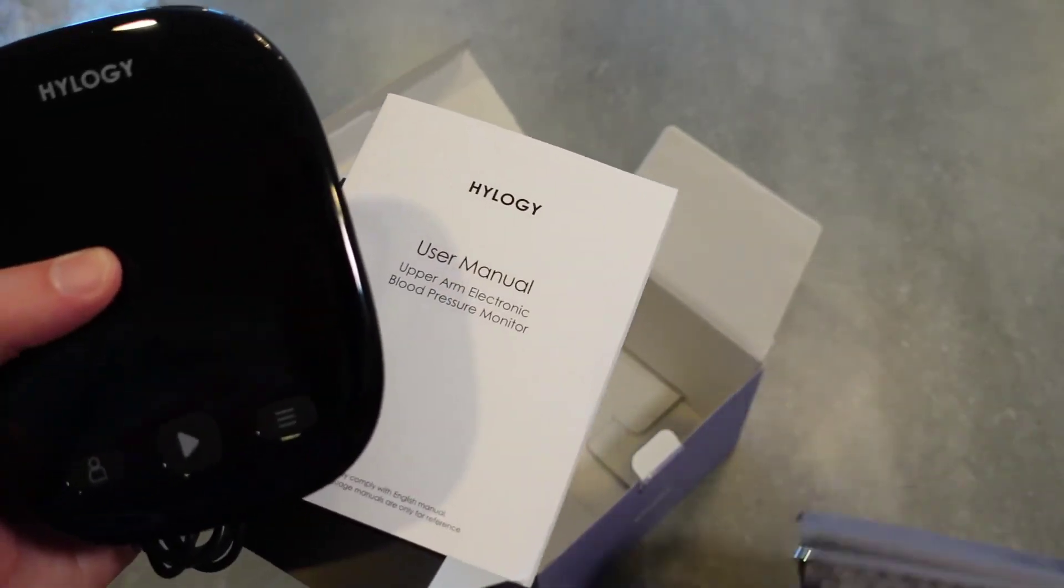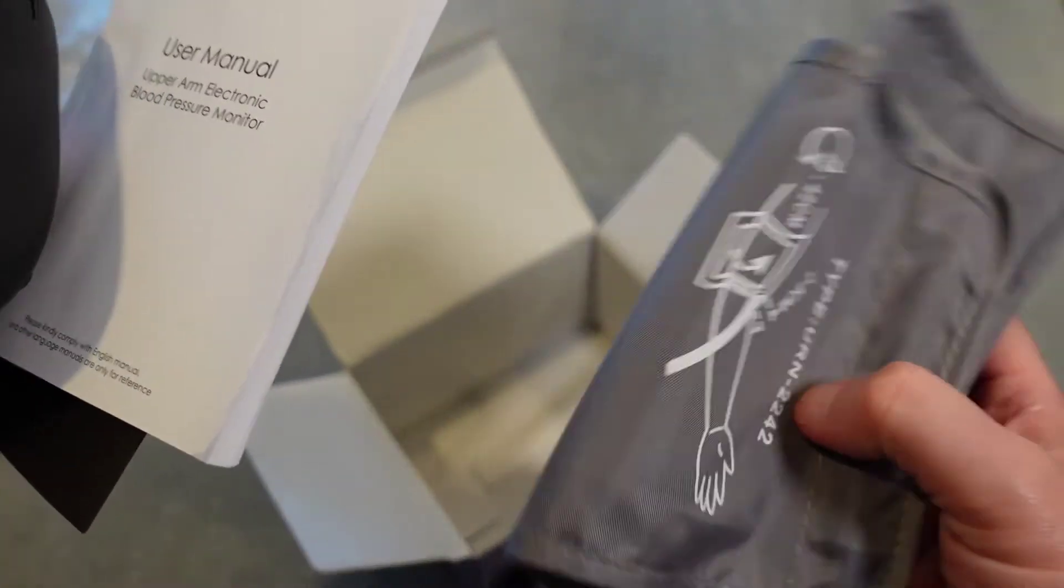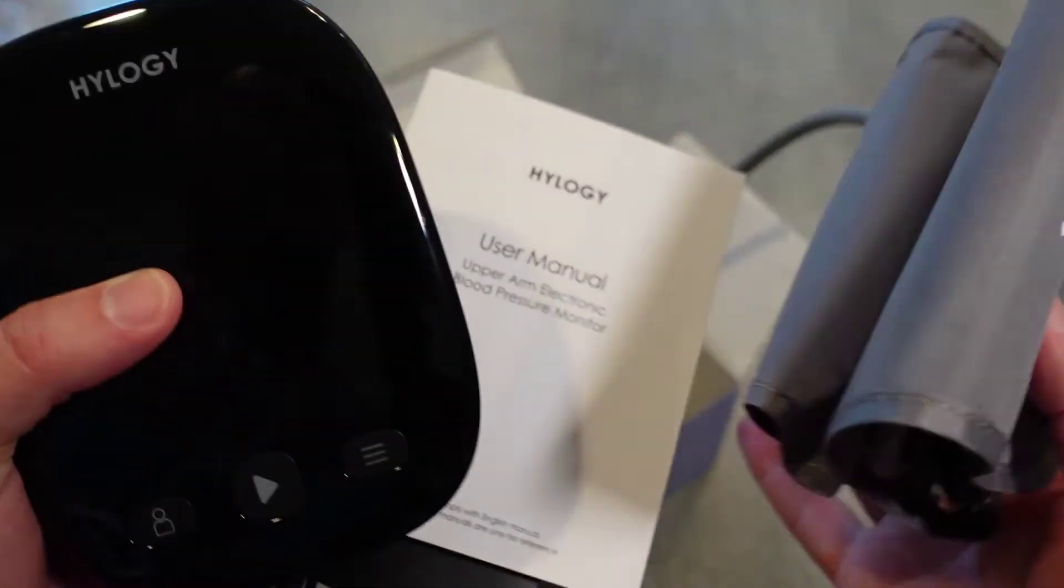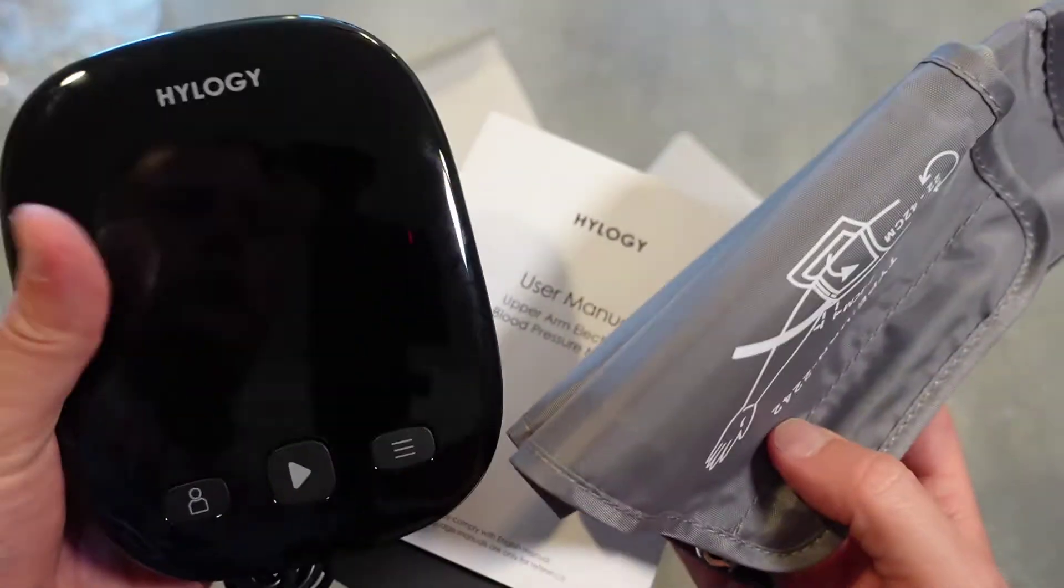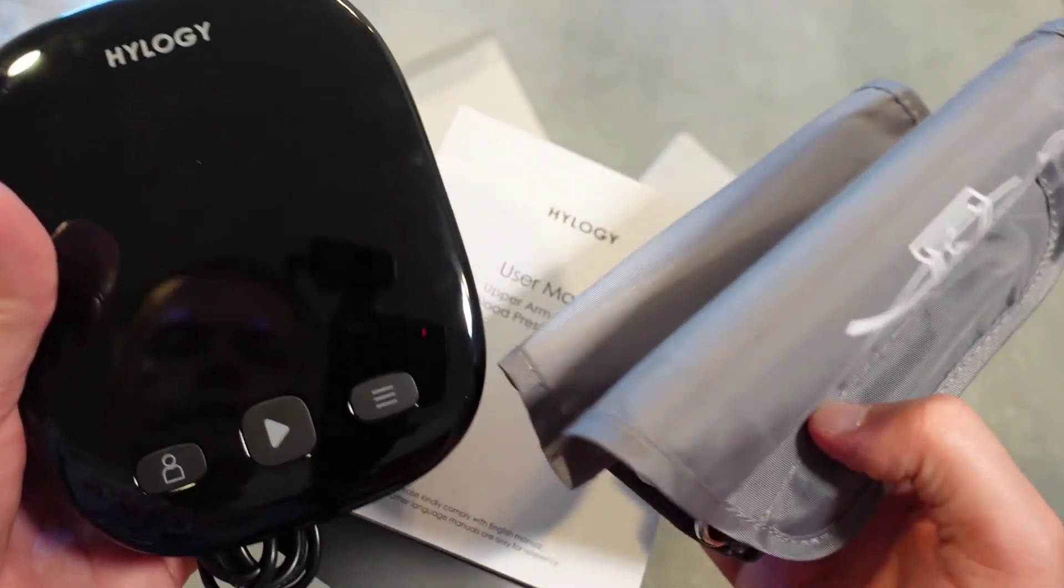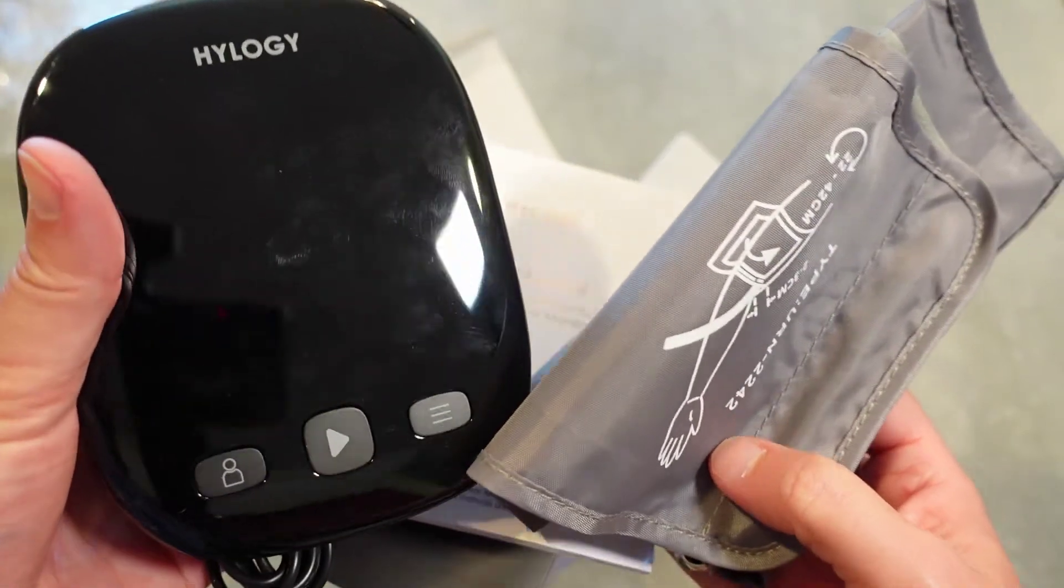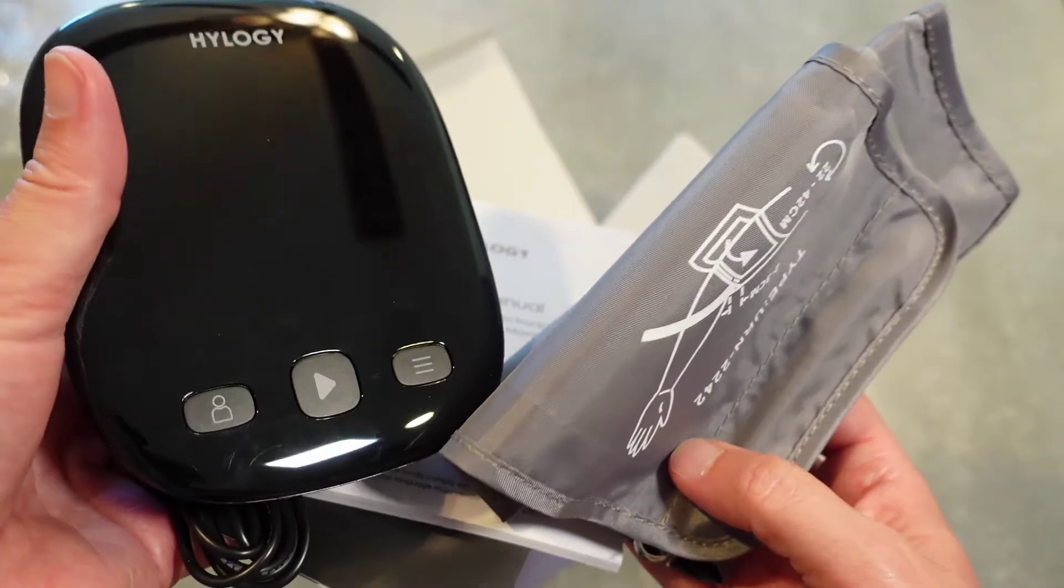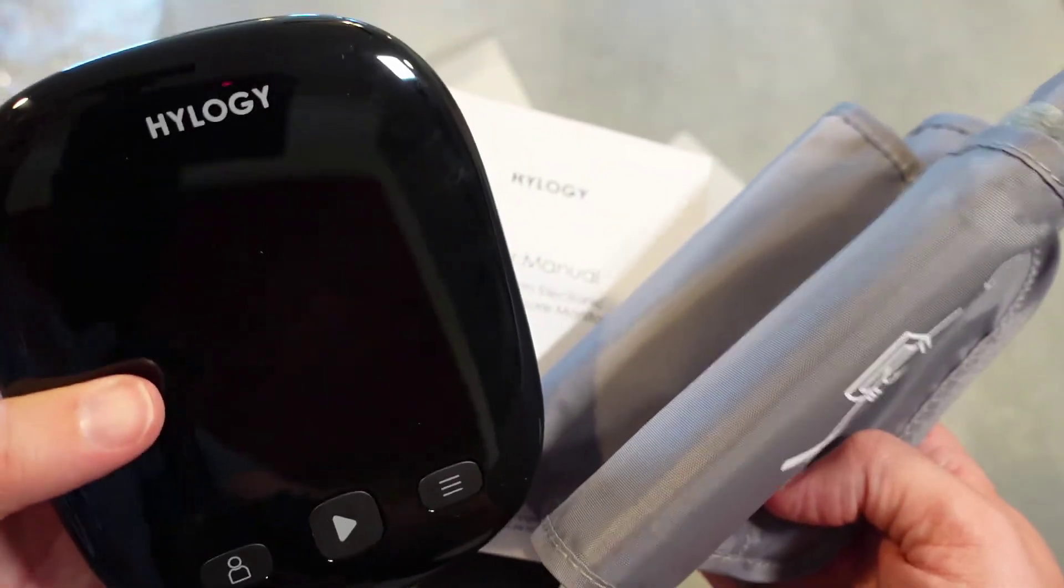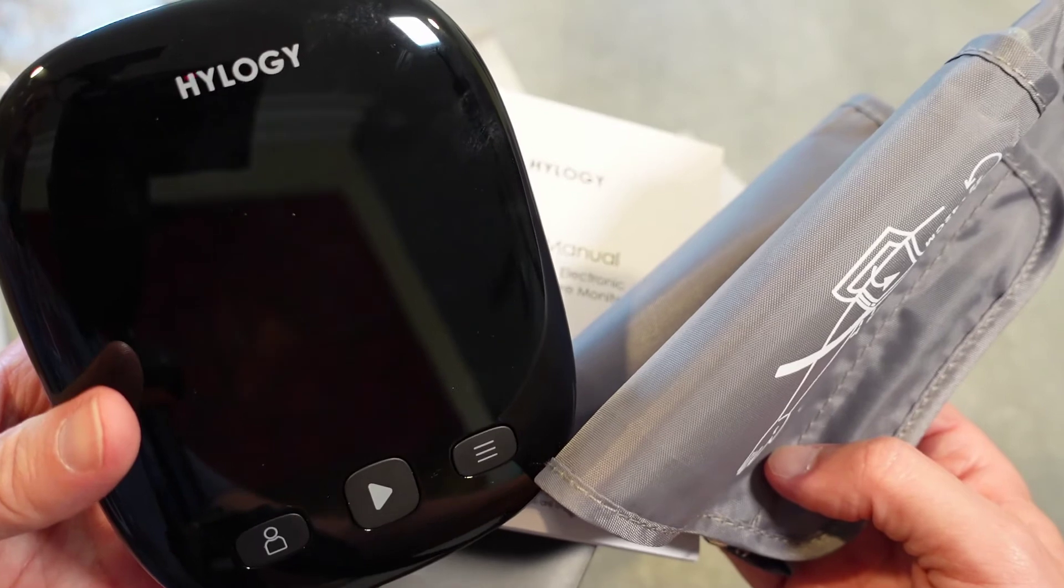Your large to small cuff, your instruction book and the actual unit itself with the memory, and then the power cord. So if you want to run it by USB type-C power, and that's it for the unboxing.